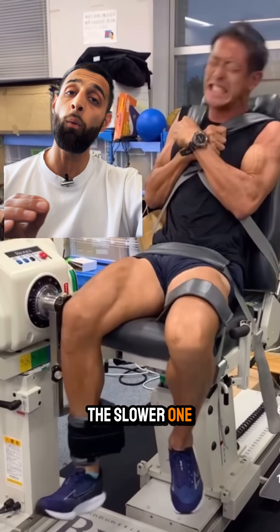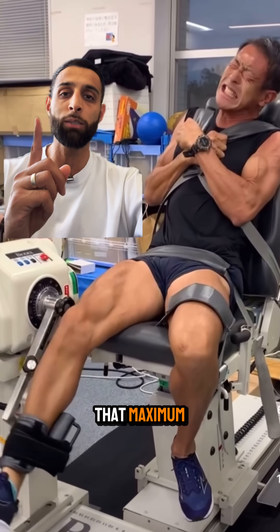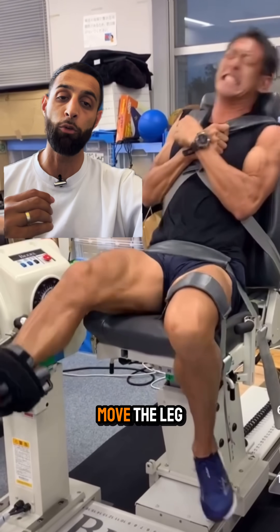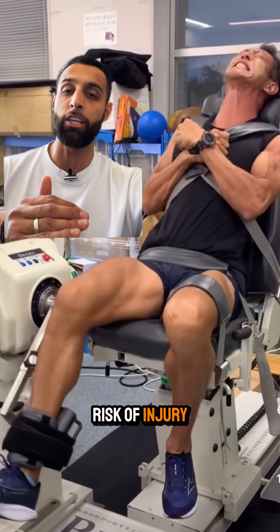Both are very important. The slower setting checks maximal force and how fast you can get to that maximal force, whereas the faster setting checks how quickly force can ramp up and how fast the leg can move. Both are important when trying to return somebody to sport and reduce the risk of injury when they get back.